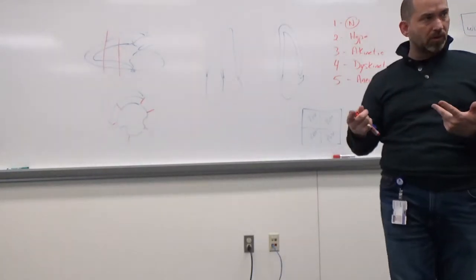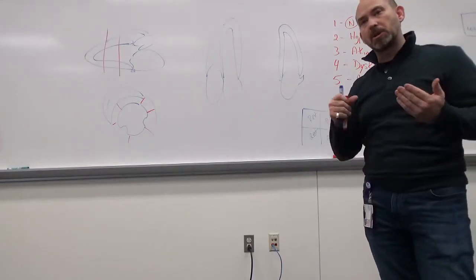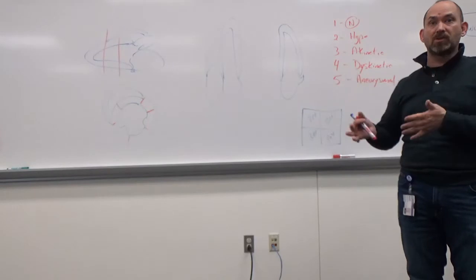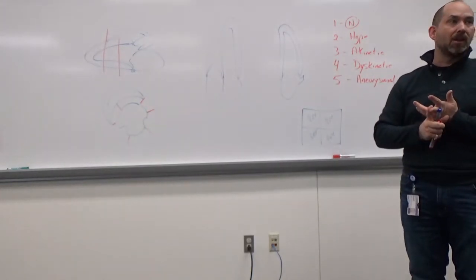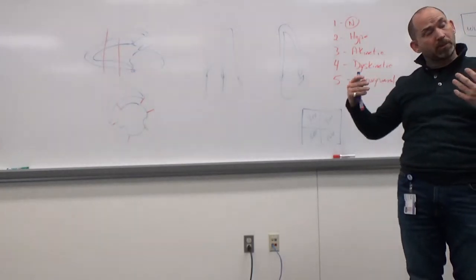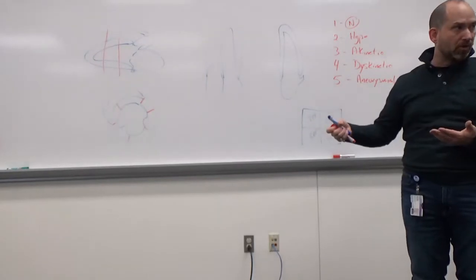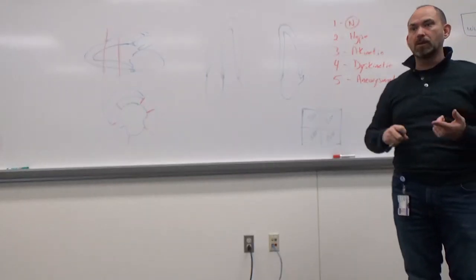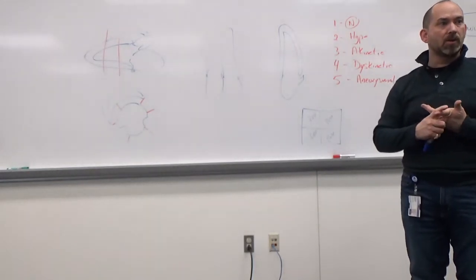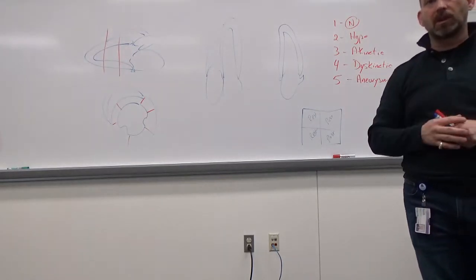Severe aortic stenosis could be a risk, and nowadays they are starting to do some of this. So be aware that there's some absolute things that I'm absolutely not going to do. If they've had a recent heart attack and the angina is unstable, I'm not going to be doing a stress test. But if they've had a heart attack, they could have had a bypass surgery and they're stabilized and they've gone through procedures, and maybe we're doing it just to see how well it's tolerating it. We could be doing it on somebody who has permanent wall damage already from a prior heart attack. That's okay as long as it's stable. Those are kind of relative things.